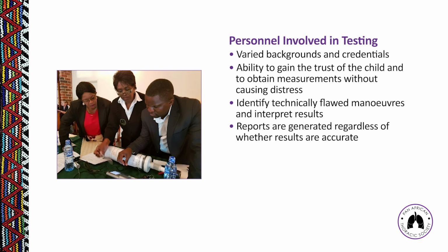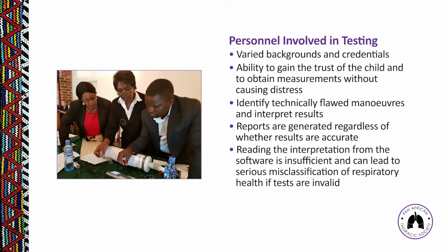Commonly used spirometers will generate printouts and reports regardless of whether the results are accurate. So it really is up to the technician and the person interpreting to look at the spirometry test result, to read the flow volume and volume time graphs, to look at any problems that have occurred, any artifacts that might be there that might lead to a serious misclassification of the individual's respiratory health. So simply reading a spirometer's interpretation printed out is totally insufficient.